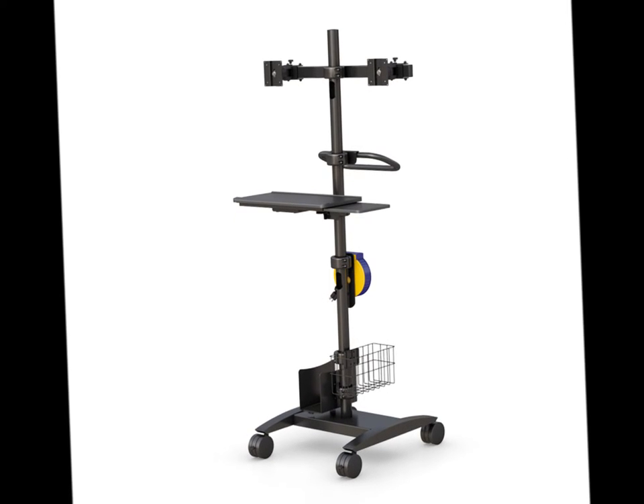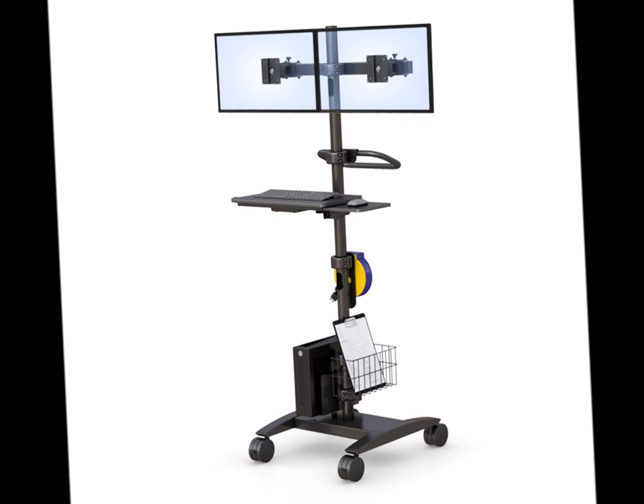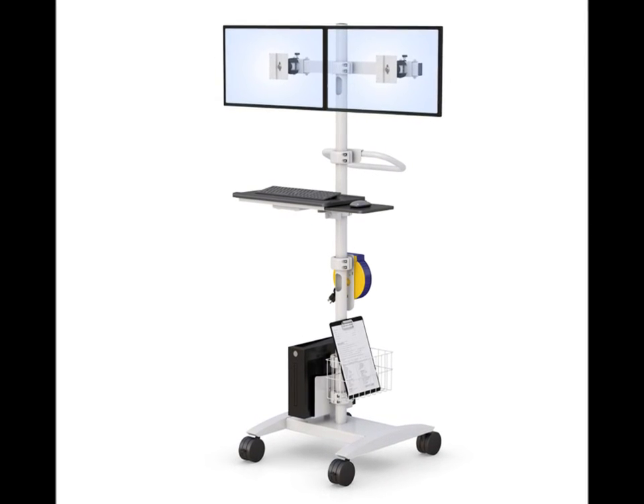This mobile medical pull cart has a mounted dual monitor arm, mounted CPU holder, ergonomic keyboard and mouse tray, wire basket, and a weight balancer that keeps the balance of the pull tray. For more details, click the link in the video description.